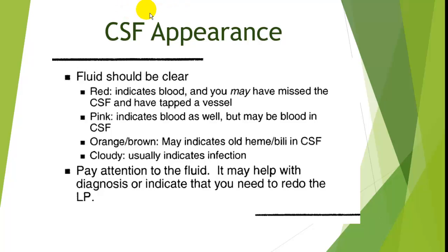Spinal fluid can also be cloudy, which is usually an indication of an infection, or even yellowish if there is any jaundice or raised protein in the fluid. You can take the fluid, hold it up against a white printed piece of paper and see if the black print is readily visible, usually an indication that it's entirely clear CSF.